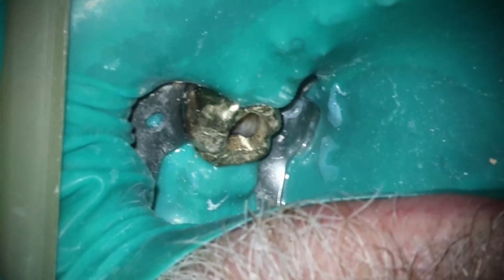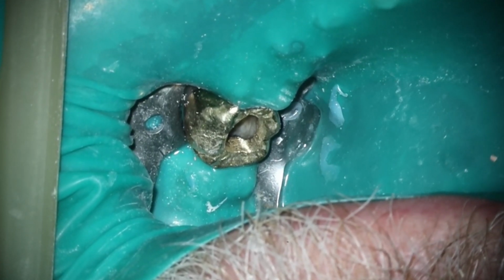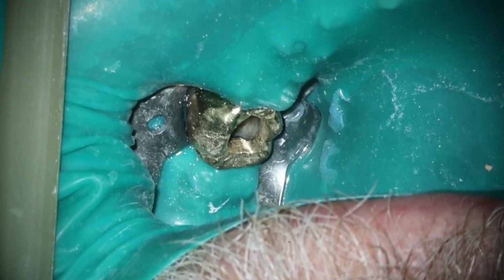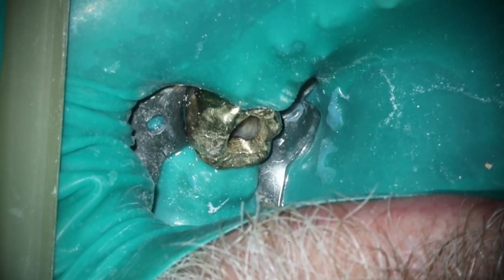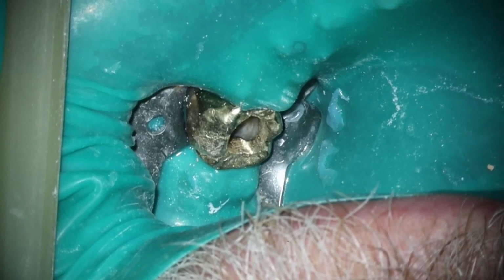But what we cut out there was the photo and taking the x-ray. So it looked great as far as the down pack, and now we're going to be filling it up. I ended up needing three spill amalgam compules to get this fully sealed. So that tells you just how large that access was, that it took that large an amount of amalgam to actually get it inside there.